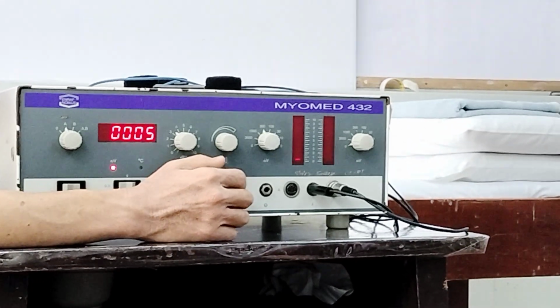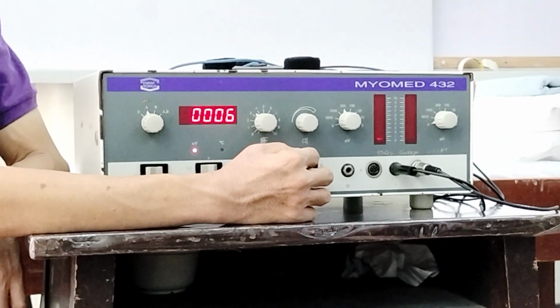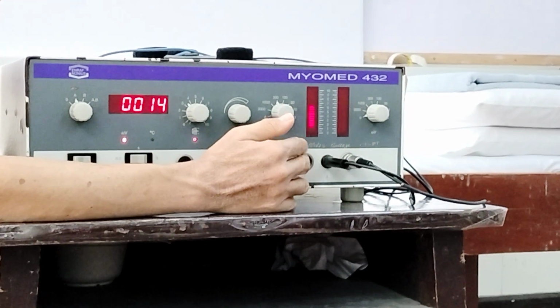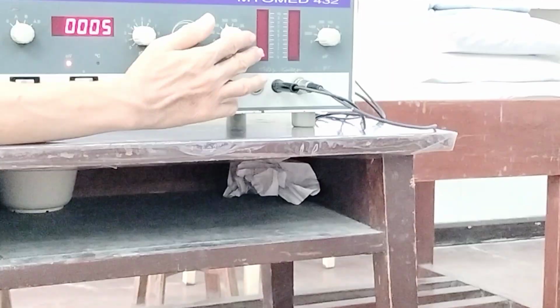So it doesn't mean nga kinalayo mo yan. So usually expect that the involved side would have lesser. So let's just say ang sa involved side, kaya niya is 10 microvolts. Yung good side is 50% or level 5 sa 300.